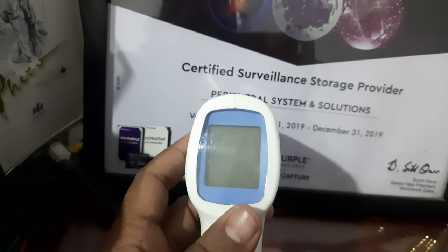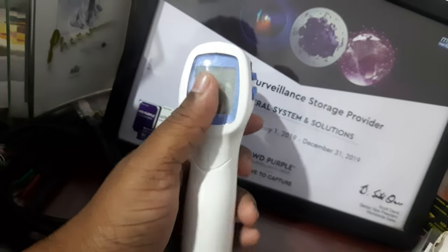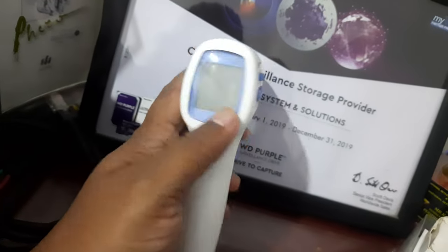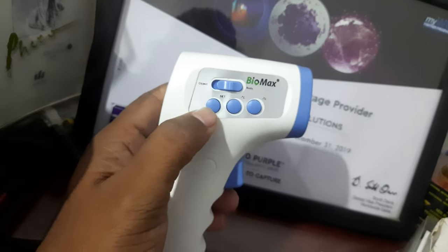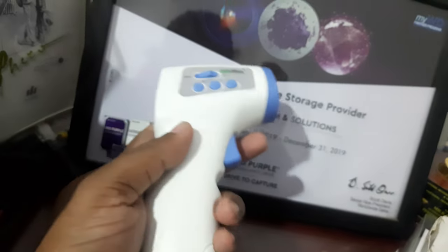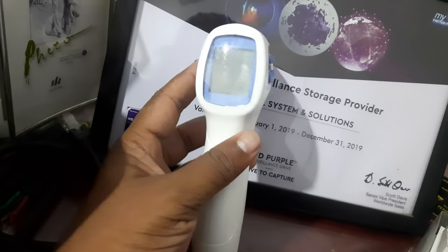I'm going to show you how to convert any brand thermometer from Celsius to Fahrenheit and Fahrenheit to Celsius. All thermometers will have three buttons like this, so if it is in the battery condition, just press this trigger.